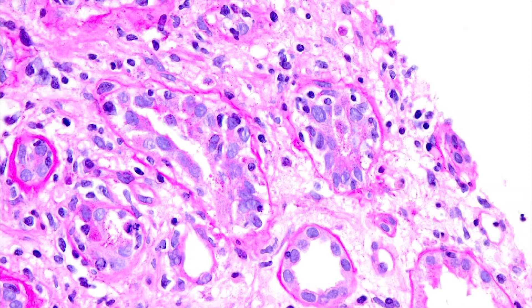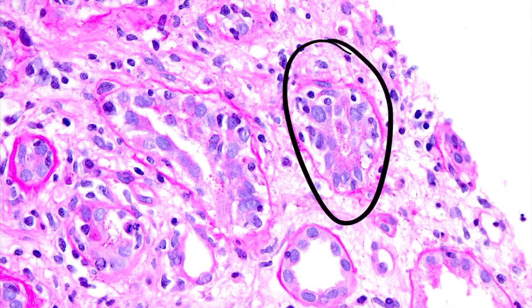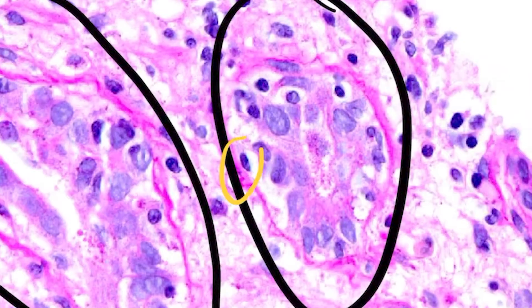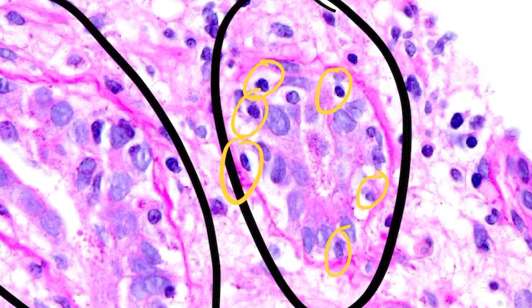As we move into the next image, we can see these tubules at a higher power, all of which show tubulitis. And if we count, here we have one, two, three, four, five, six lymphocytes within the tubule, consistent with moderate tubulitis or a T2.